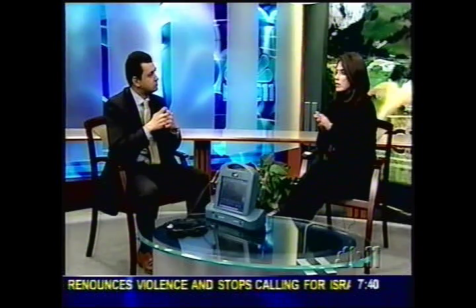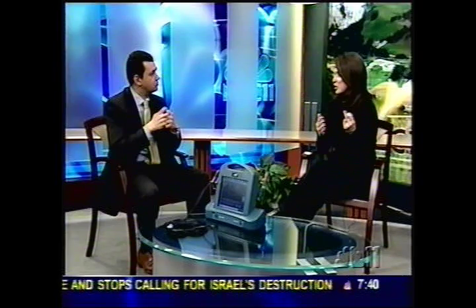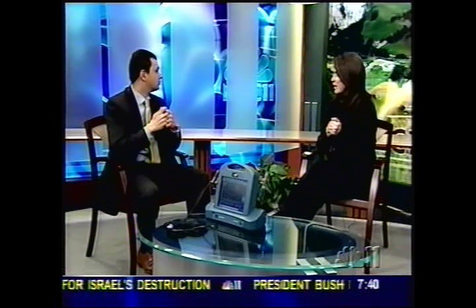And the idea before was that there was no way to tell if that tissue was thriving and healthy except to maybe poke at it and make it bleed and say, oh, okay, it's still alive. So this takes the pain out of that. How does it work then?